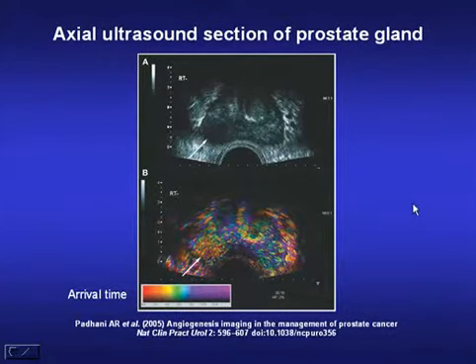We've had difficulties until recently applying ultrasound contrast techniques to organs such as the prostate, partly because the high frequencies that we use for prostate imaging are not really compatible with the microbubbles that are available, but different size microbubbles, different composition microbubbles respond differently to different frequencies, and we're gradually learning how to do this.